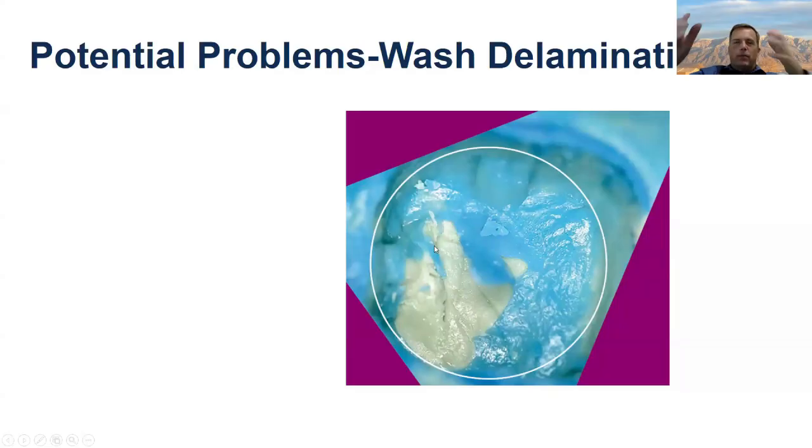But the bigger problem is that unless you're using a very, very sturdy tray, when you push that tray down, the base material balloons. And then, of course, same problem as everything else. When you release it, that springing force compresses your dies. That impression technique is notorious for making things fit tight. And of course, there were different model techniques and different stuff like that. But please, please help your laboratory and don't do that technique.